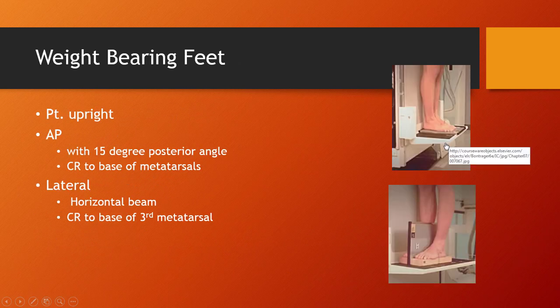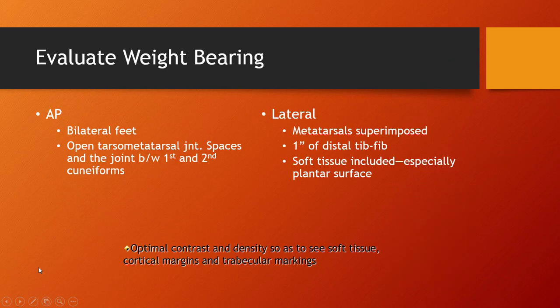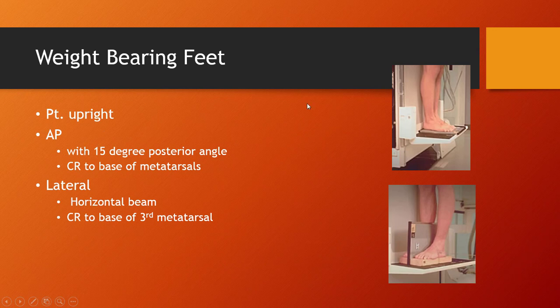We also get requisitions for weight bearing. If you're doing a weight bearing foot, you do need to have your patient stand upright. Some places will have a bucky tray that goes down far enough in the fluoro table that you can do these, or your bucky tray on the wall will actually come all the way down, or they'll have a set of stairs that your patient can stand up on to do these.